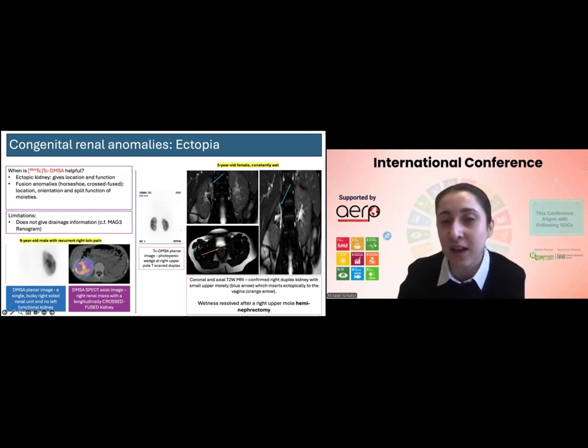And then on the right side, a 5-year-old female who initially presented with urinary incontinence together with a normal voiding pattern. And they had an ultrasound, a DMSA scan, which showed both of the kidneys were relatively well functioning. However, there was a photopenic wedge at the right upper pole, which I hope you could appreciate on the right side, which could have potentially indicated some scarring.